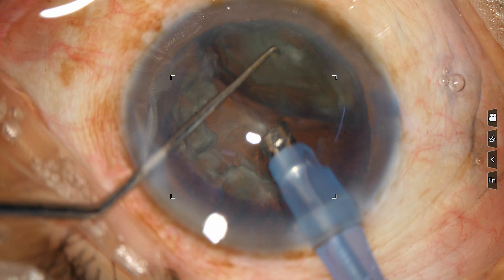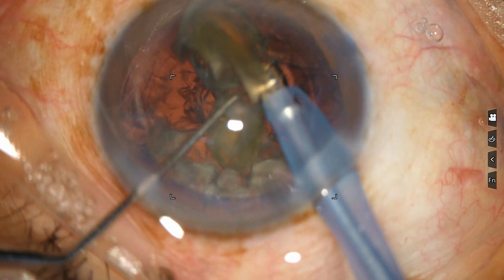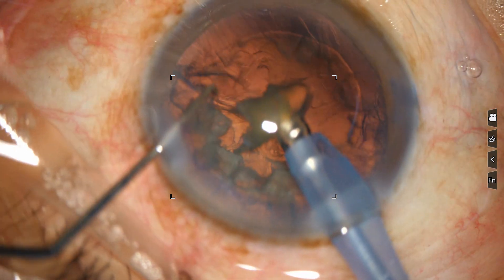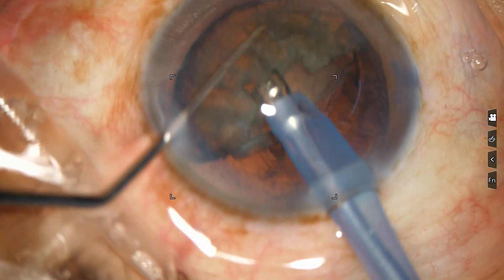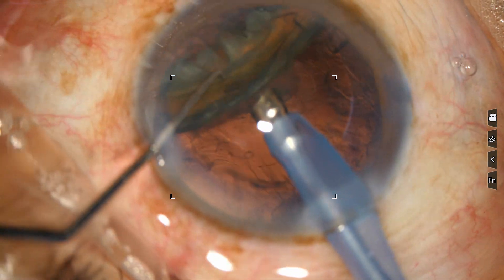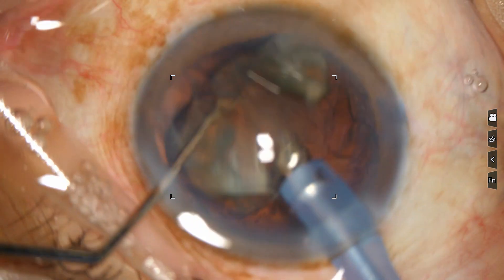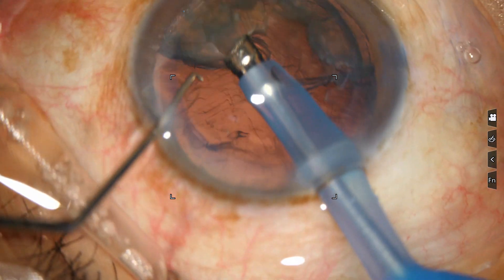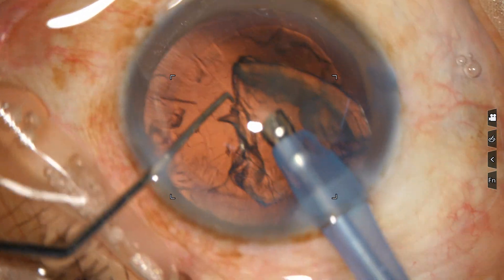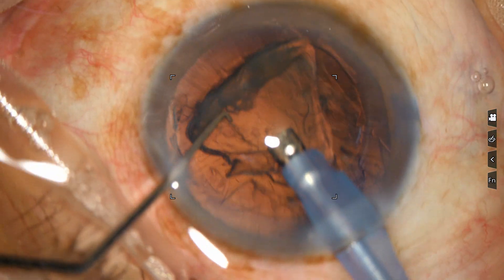This is a big piece. Try to hold it at the central part and divide it. Use your chopper to make it into smaller pieces. Now if this one is a big piece, try to tilt it. For the last piece, go to a lower power setting — less vacuum, less flow.